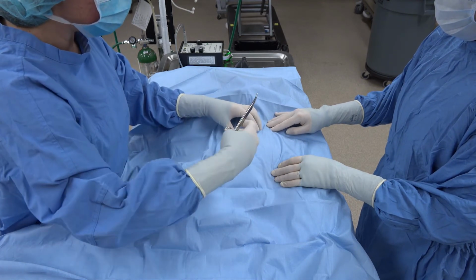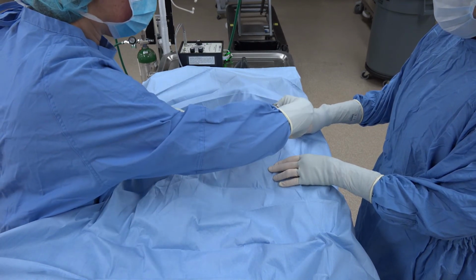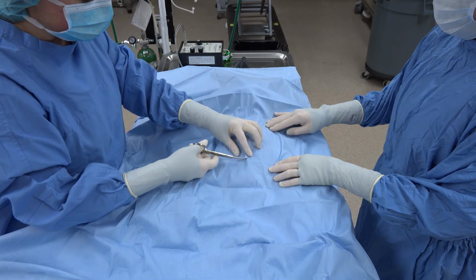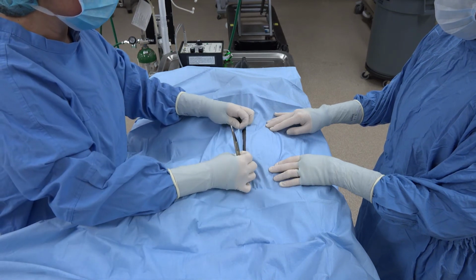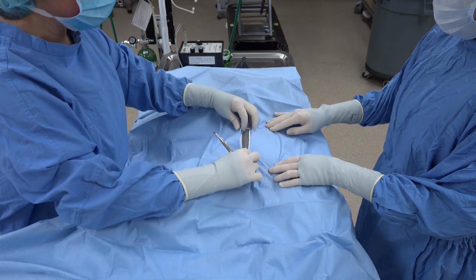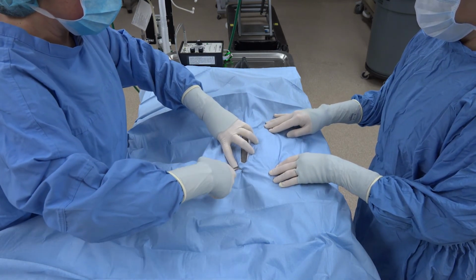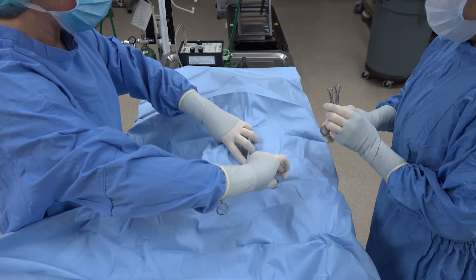Now, there's two ways to do this. The first is the way I'm doing it, which is I cut up, and then I can feel underneath where my drapes are and where my towel clamps are. And I cut a little bit of two little sides here on both sides. Or you can actually cut just a circle. So you can either do that and then tuck that guy under like this, tuck this guy under like this, and then we towel clamp over the top. Where's my towel clamp? So I feel that. Now you're not going all the way into the animal, you're just going onto the towel clamp on both sides.